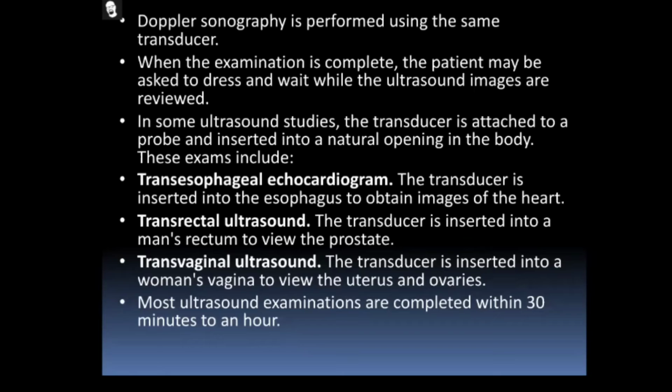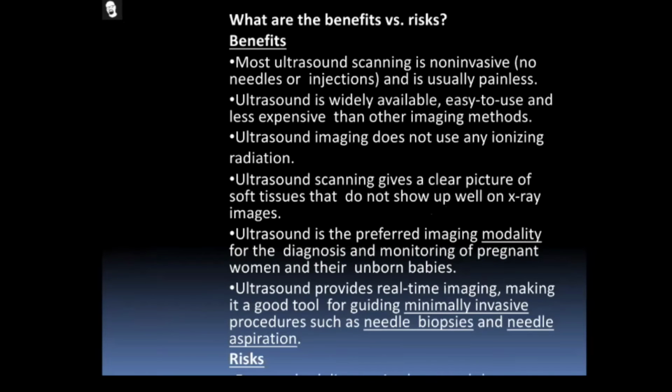For the transrectal ultrasound, the transducer is inserted into the man's rectum to view the prostate. For transvaginal ultrasound, the transducer is inserted into the woman's vagina to view the uterus and the ovaries. Most ultrasound examinations are completed within 30 minutes to 1 hour. In my experience, even 10 to 15 minutes is enough to find out what has happened in the internal organs. Then we go to the benefits we can get from it.